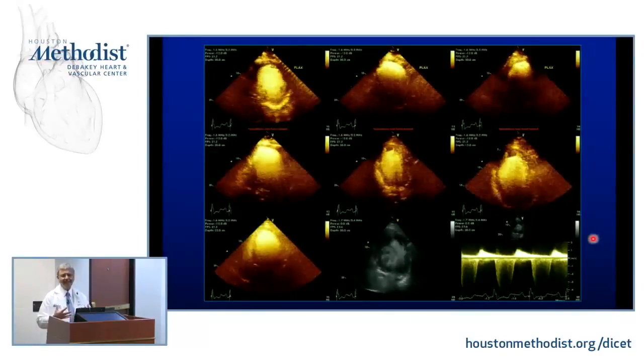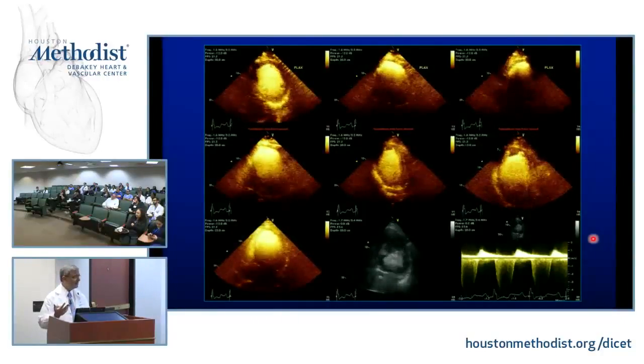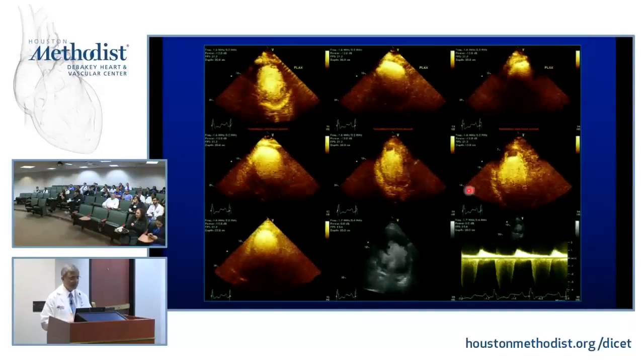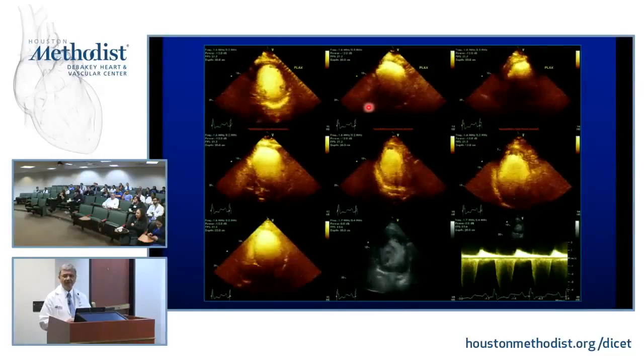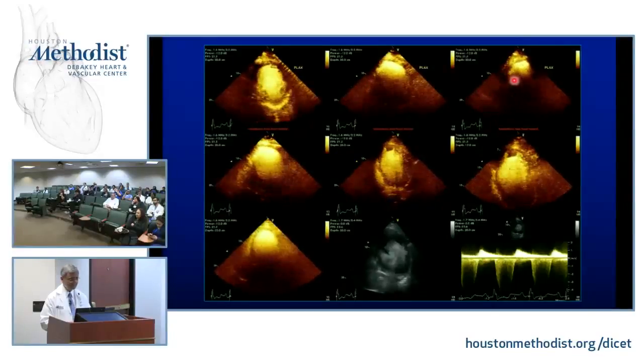The technical things that are going on in this, everything that we talked about. Which one shows attenuation? Which one shows a high MI? Are you happy with this picture? You're happy. How about this picture? Attenuation, right? Very bright, and I can't see anything behind it. So we're not done yet with attenuation. Actually, it's even worse. How about this one? It's getting better. These are sequential images.